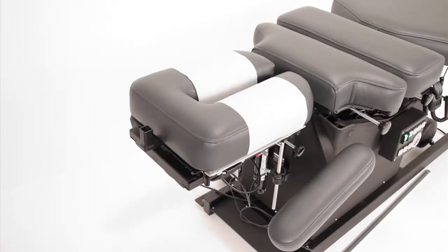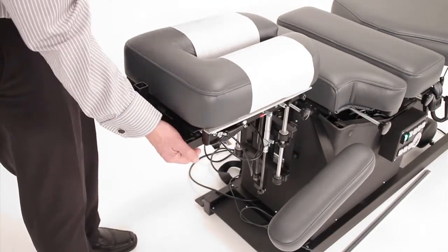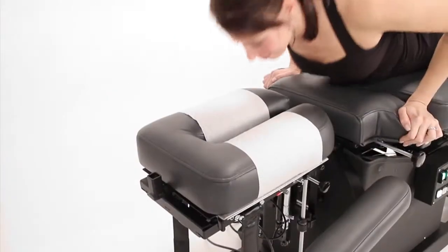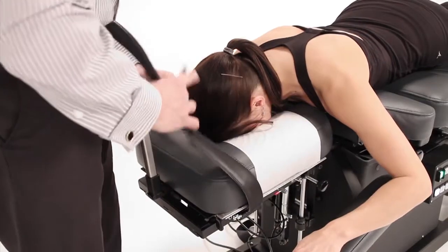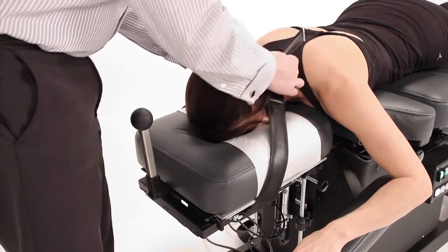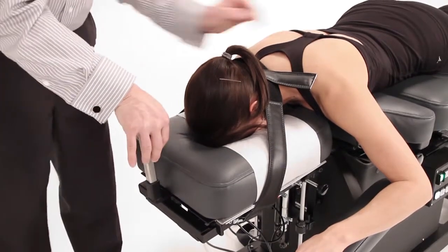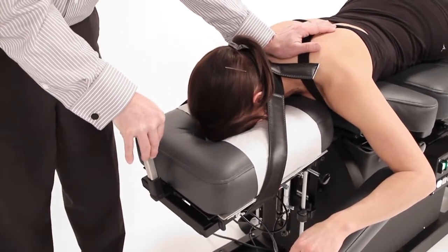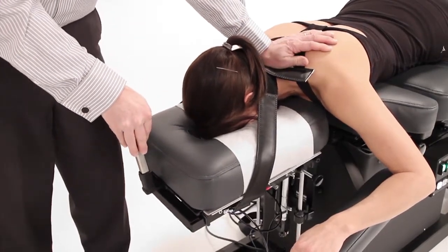The headpiece options include a raised headpiece, assisted with a gas-powered cylinder. It can rise and lock anywhere up to 5 inches. Manual cervical flexion is also available on the AirFlex. To use cervical flexion, secure the straps around the occipital region of your patient and disengage the tilting lock. Only a small amount of flexion is needed to produce successful results. Disengaging the rotation lock will allow for gentle circumduction and flexion.